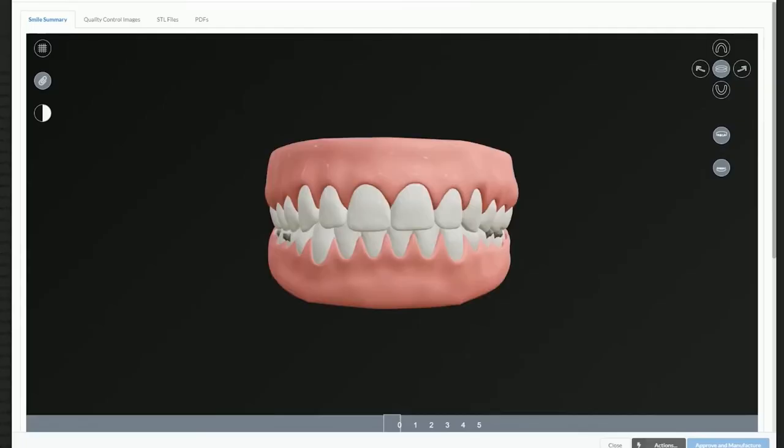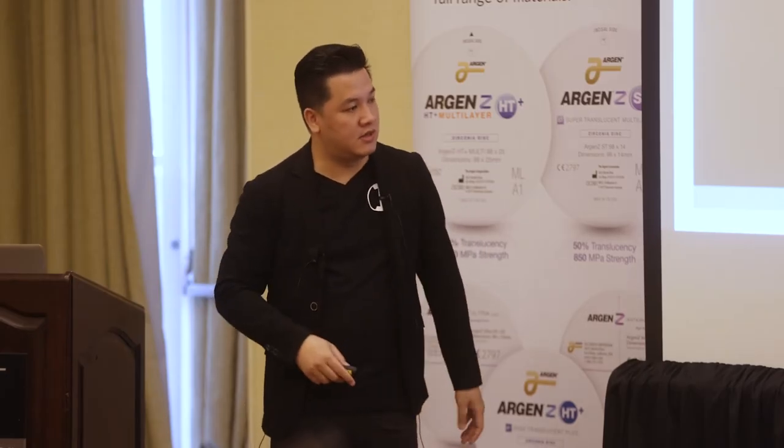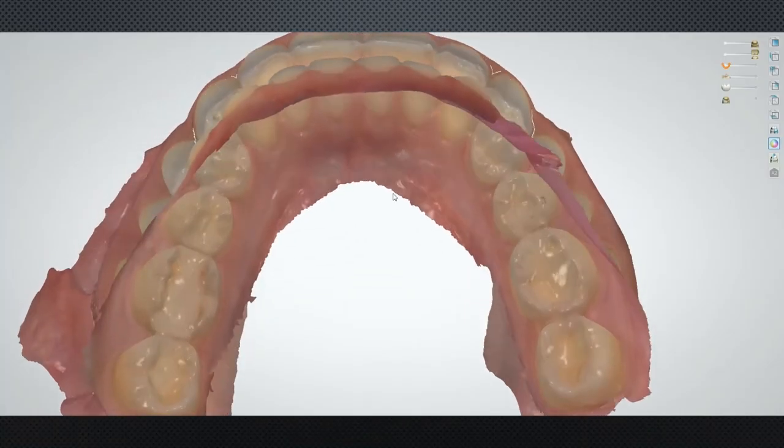And so what I do is I send it off to Full Contour here. They did the design plan and we sent it to him, and they tell us where they're going to do IPR, and it's just 5 stages. So this is like 2 months, nothing crazy. But you know, we crank it back and he does some interproximal reduction enough to get her to the point where we need to do some lingual veneers.